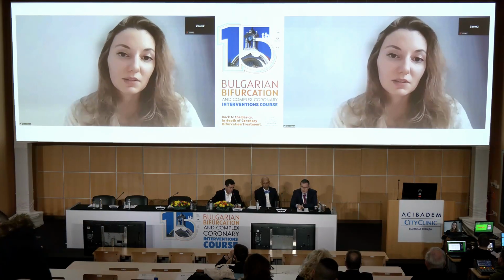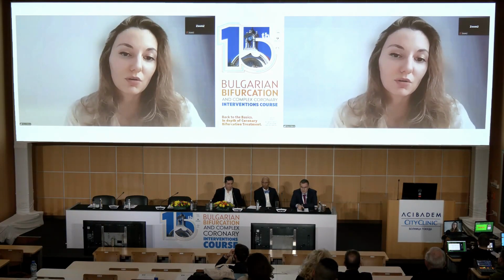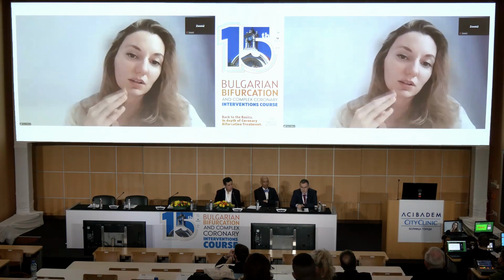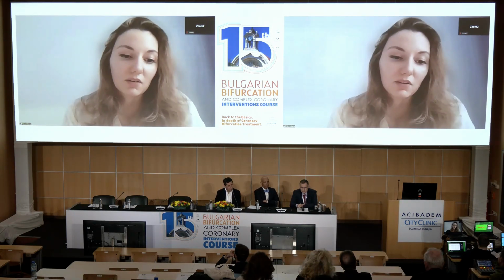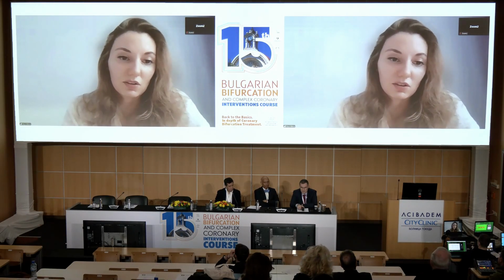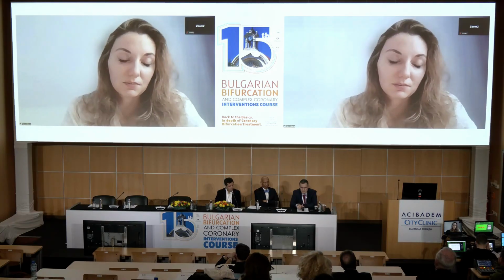Yes, this is something that we do. The protocol with a previous bypass patient is a little bit different so that we can have all the bypasses in the acquisition. And I think we have pretty good visualization in these patients.